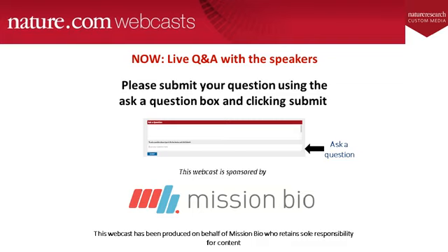Excellent. Thanks, Alexander. And our next question is also for you. This one asks, with error-corrected sequencing, do you think you could have gotten similar results? That's a good question. With the caveat that I haven't personally worked with error-corrected sequencing, I would say that it's true that you could get similar results from any highly sensitive technique, but there are certain advantages to being able to show that the mutations you're looking at are actually cell-specific.